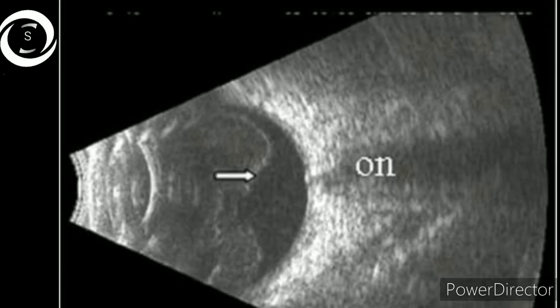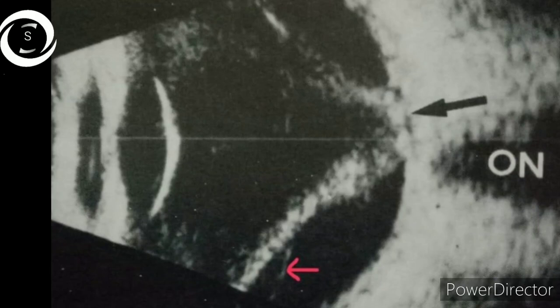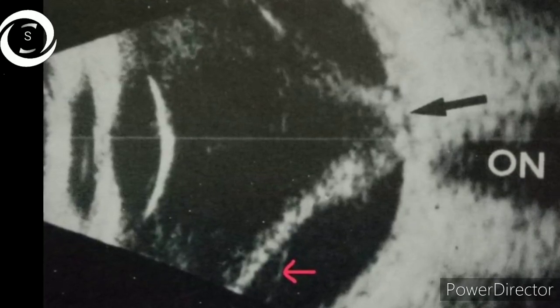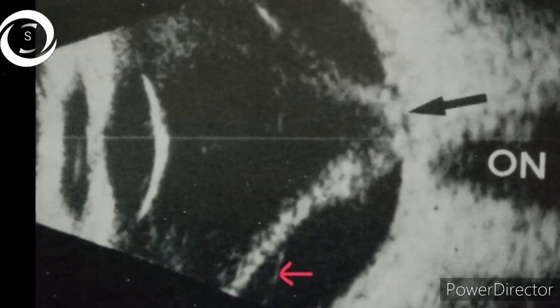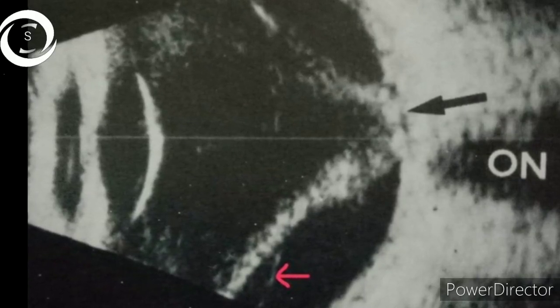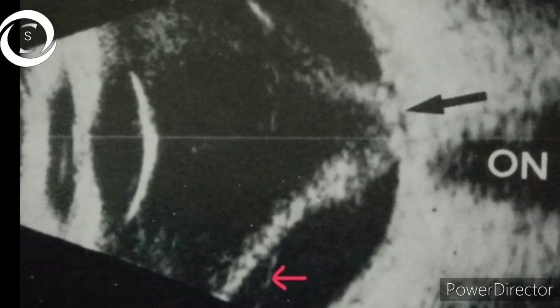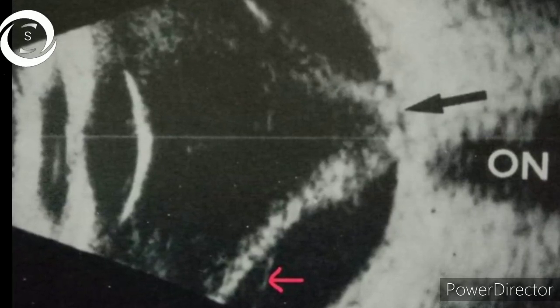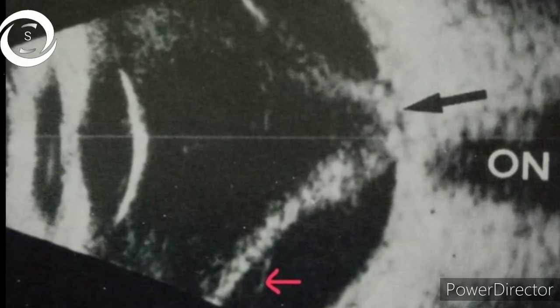In this fourth B scan, there is an open funnel-shaped thick membrane looking like retinal detachment. Observe closely the thick concavity of the crystalline lens and the attachment of the PVD at one side of the optic nerve. Remember, retinal detachment is attached on both sides of the optic nerve. This tricky B scan shows thick old PVD mimicking RD, visible clearly at very high gain.